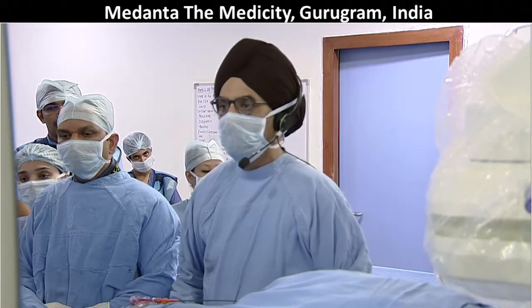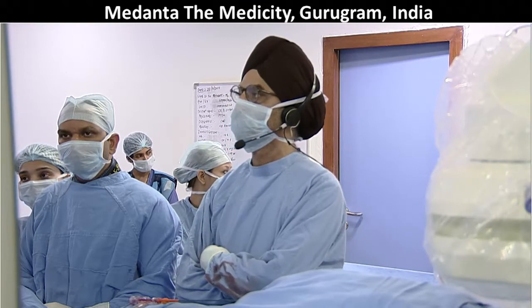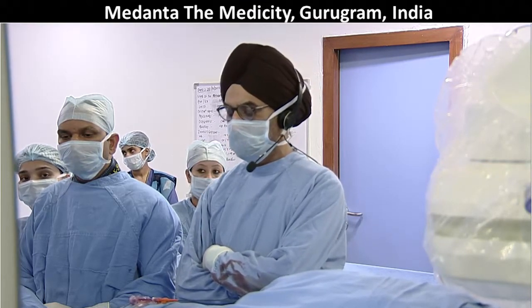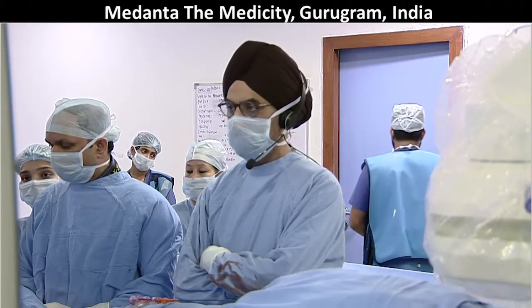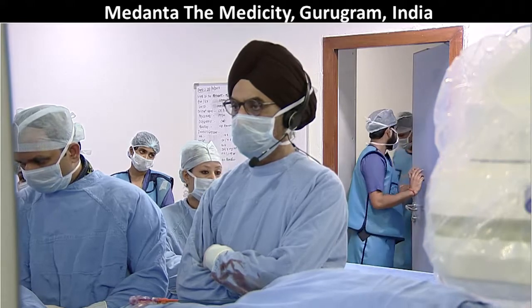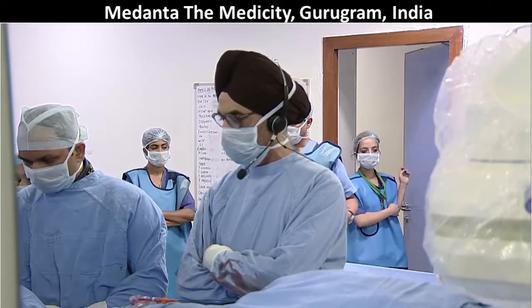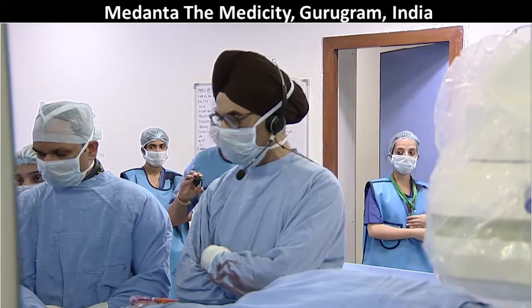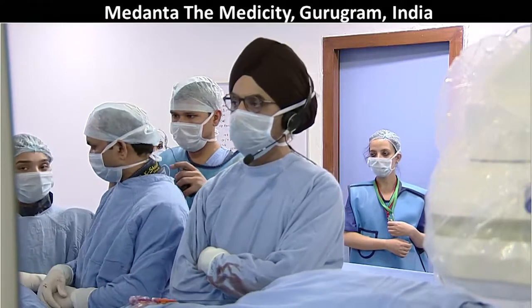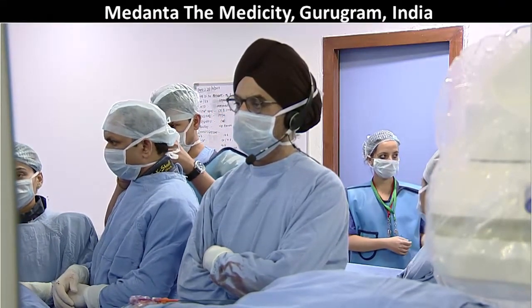Right. Dr. Lee, with a lesion like this one, though, the ostium of the circumflex is not critical enough. Most of the time, when the LAD ostium is treated with a stent, plaque shift will occur, and there is danger to the circumflex. So in these cases, I would treat it with the 2-stent technique. But given there was a size discrepancy between the left main and the LAD, I would do the IVUS check first to see whether the stent could be expanded to the left main size.